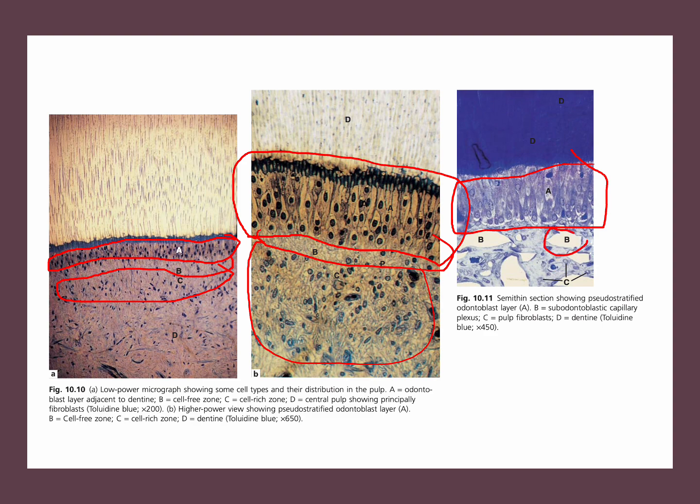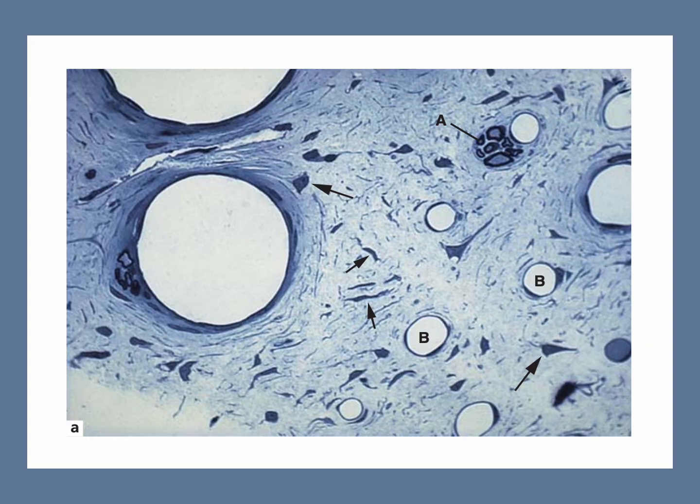Here are some capillaries. As you can see, thin-walled, so most probably they are venules. At this section, remember, we have seen this structure before, right? This is a neurovascular bundle. We have seen it in the last part. Just get used to this view, as this is the typical view of a neurovascular bundle with the nerve part and the vascular part. They come together.